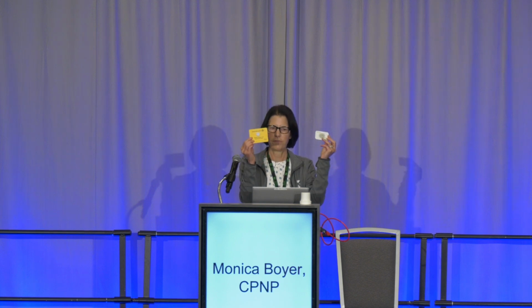You can see they're both very small. These newer generations have become easier and easier to use. The technology's easy. They're now coming in just one applicator instead of a two-piece application. The Dexcom now comes in a single applicator. The Libre's been this style for a little while. They're super simple.